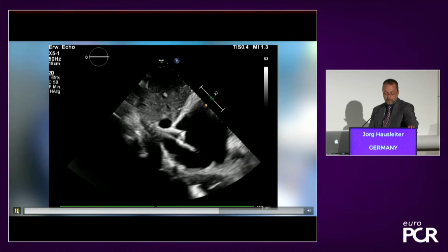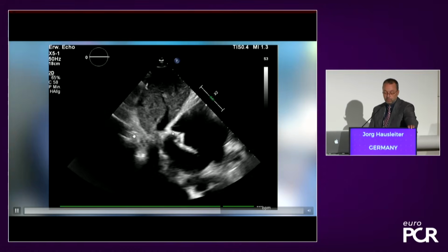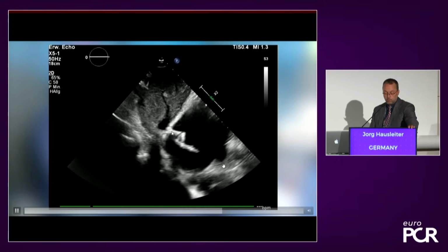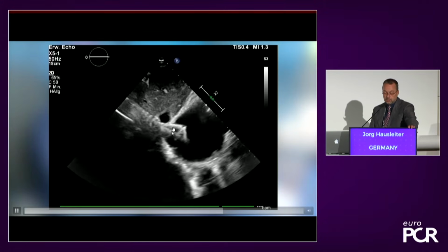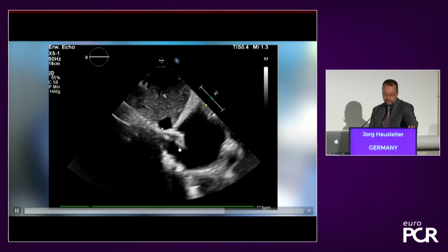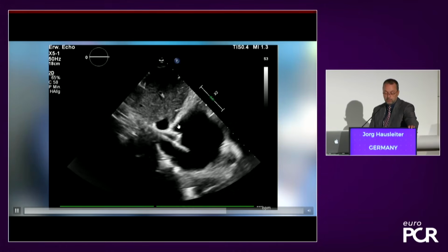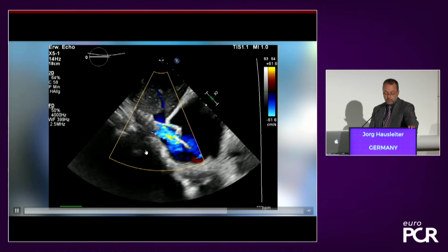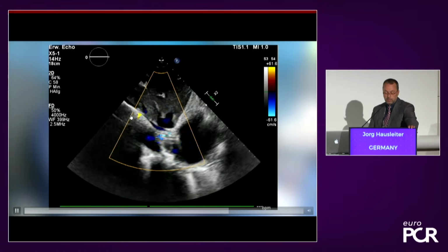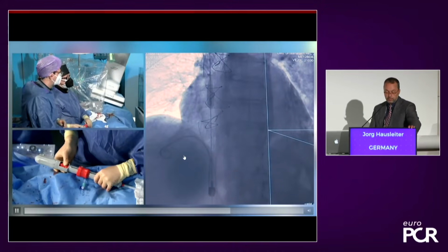And then by transthoracic echocardiography, we can appreciate now here the inflow part of the inferior caval vein into the right atrium. This is the stent, this is the wire. We can measure this distance. Usually we want to have a height of around 15 to 17 millimeters, so that we get a good sealing. Right now, just the upper part is opened, not the lower part. So there is still some backflow, but as soon as we further expand the stent, as you will see, we're trying to see that we're really generating a good sealing.